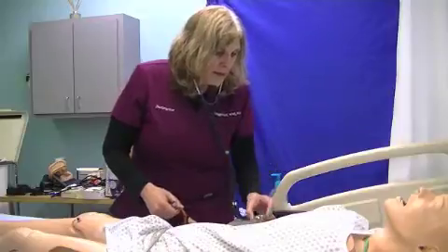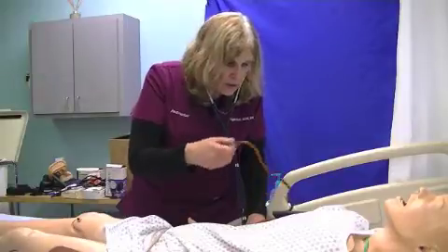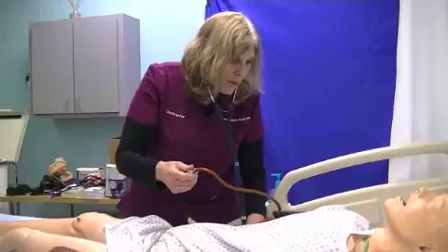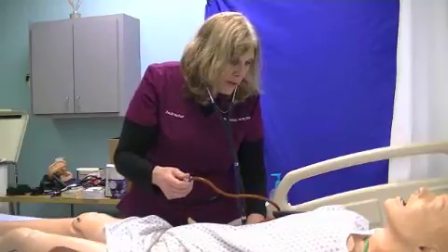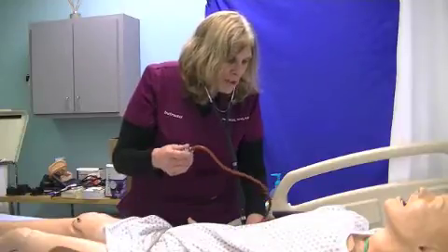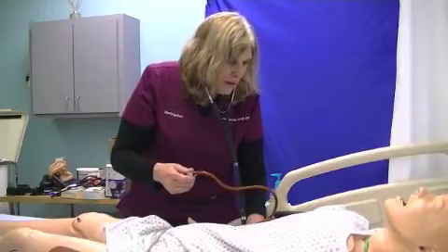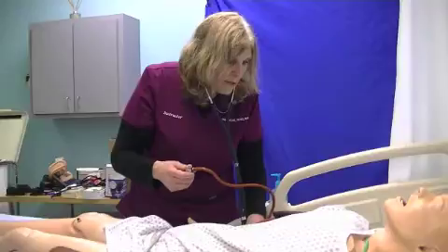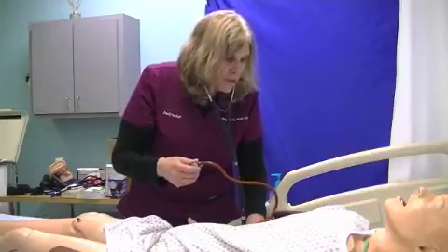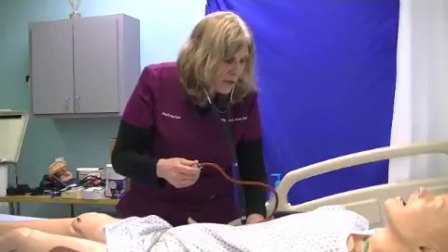Then I'm going to take my stethoscope, put it right up there, and start using my thumb. I'm going to bring this towards me and start loosening it. I want to go down only about 2 millimeters of mercury per second, until I hear the first sound, which is like a tapping noise. This is a Korotkoff sound. I heard the sound at 110, so I'm going to keep releasing this. The first number is the systolic number, the ventricle pushing out blood, until I hear the last sound.